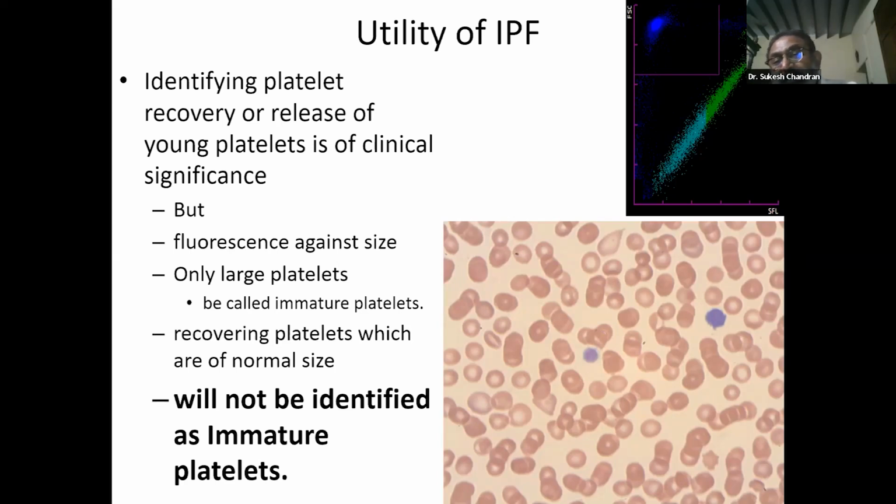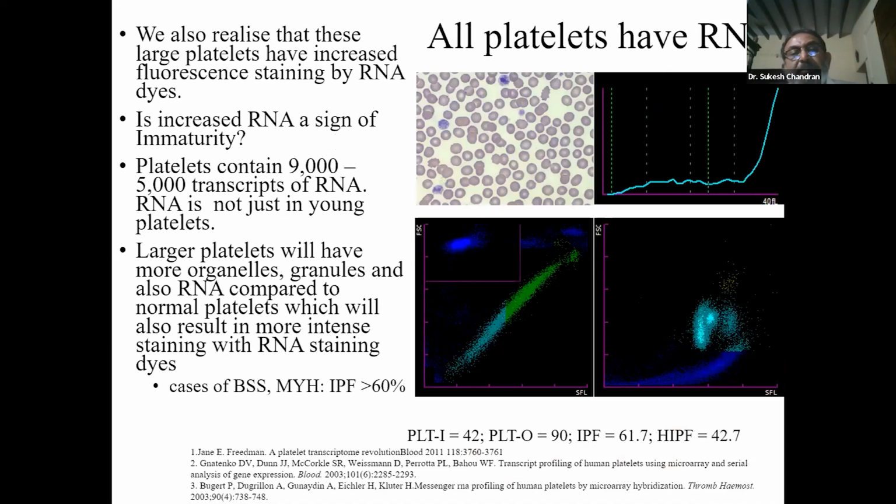When we talk about dengue, these platelets are functionally more active. If you call something immature, will you call them inactive or non-functional? These platelets are more functional. So it is a misnomer. It's a very bad thing. So we should not call anything immature platelets.